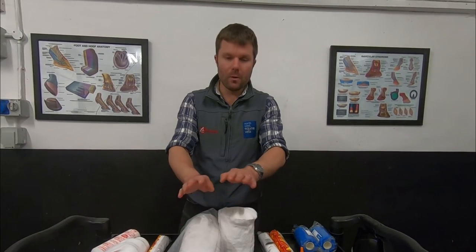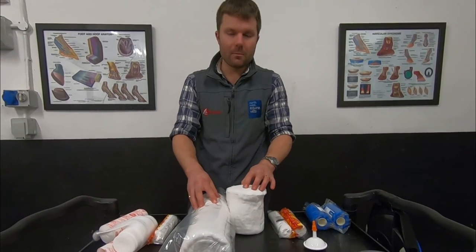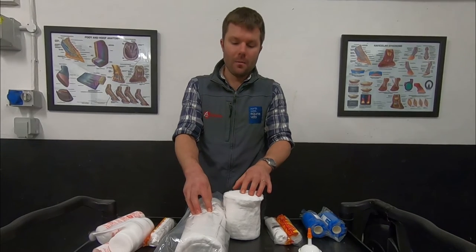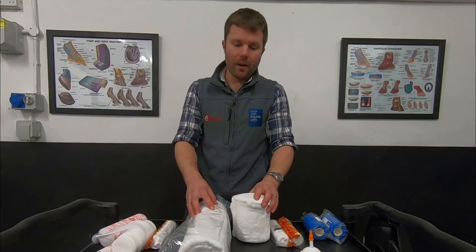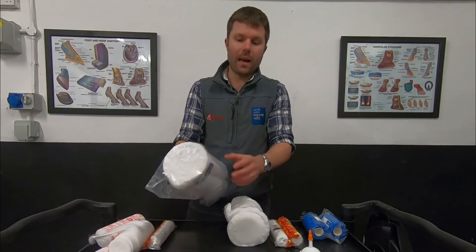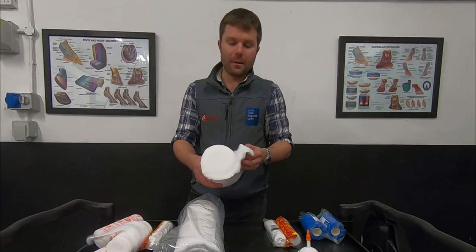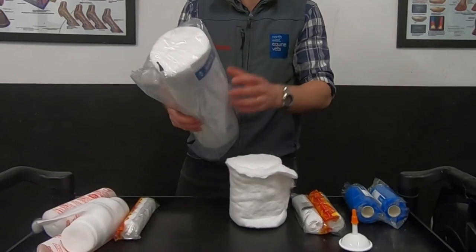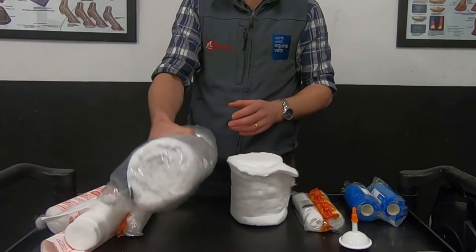The next layer, and the most important one, is cotton wool. Depending on where you're bandaging and how much pressure you're applying, you can put on one, two, three or even four layers of cotton wool — though obviously the bandage will get bigger and bigger with more layers. I find it quite easy to have two thicknesses of cotton wool: a whole roll for doing above the fetlock up to the knee, and a half-width roll for doing beneath the fetlock down to the foot, since trying to wrap a whole roll around the fetlock at that 45-degree angle can end up kinking and looking a bit of a mess.